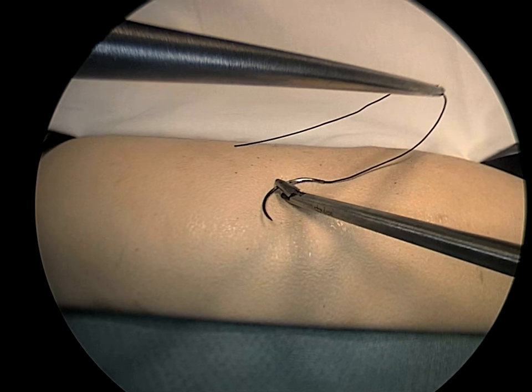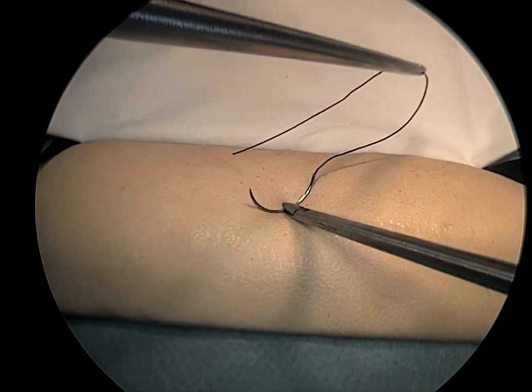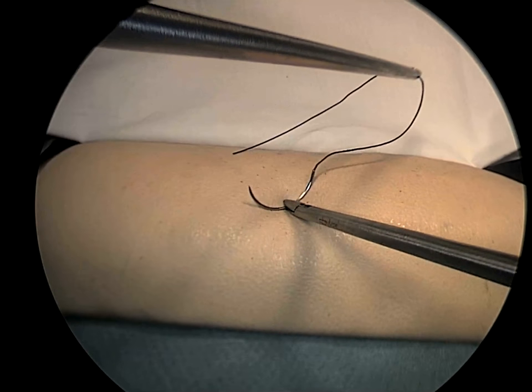Demonstrated here is a self-righting technique. Note the lower instrument blade pressing downward into the soft tissue, creating a curved hollow into which the needle rights itself under the downward grasp of the upper blade.